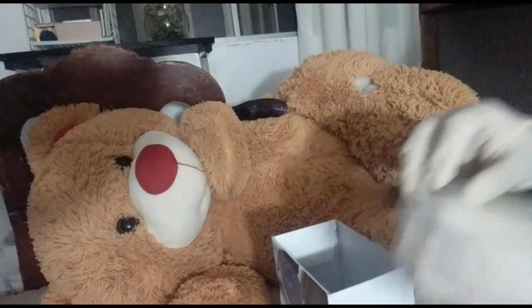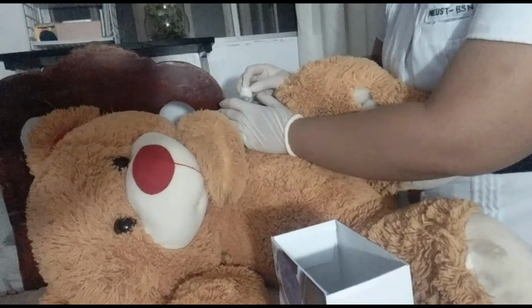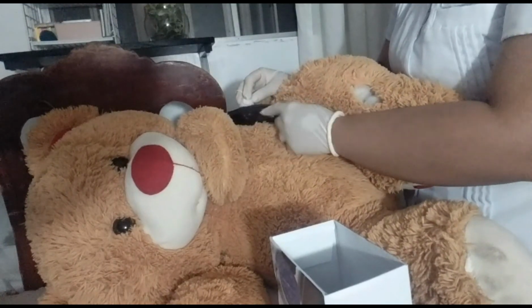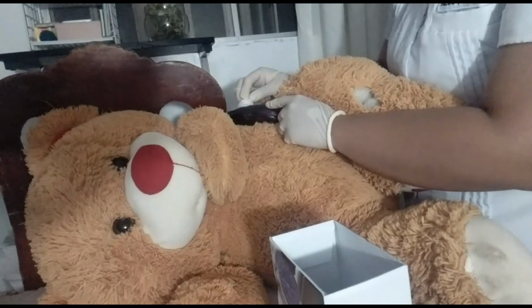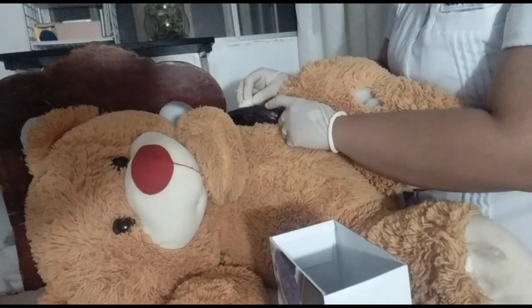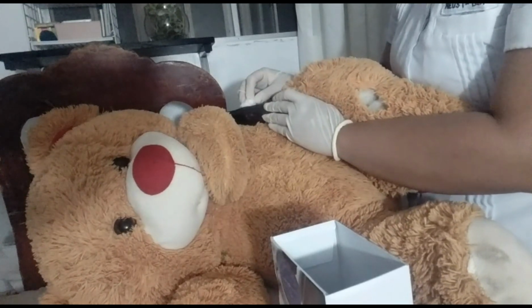I will apply gentle pressure at the site with a dry sponge or dry cotton ball, and I will ask the patient not to massage the area of the injection site.